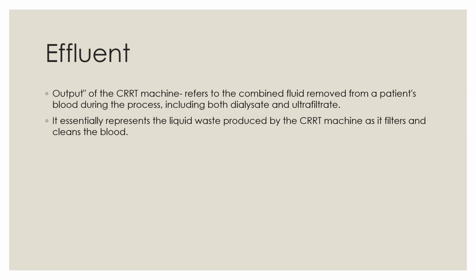Effluent. It refers to the combined fluid removal from a patient's blood during the process, including both dialysate and ultrafiltrate. It essentially represents the liquid waste produced by the CRRT machine as it filters and cleans the blood.